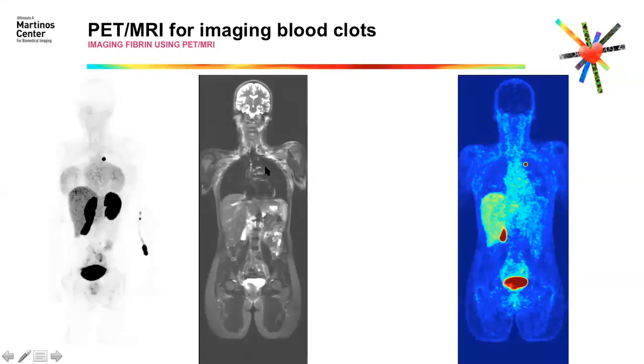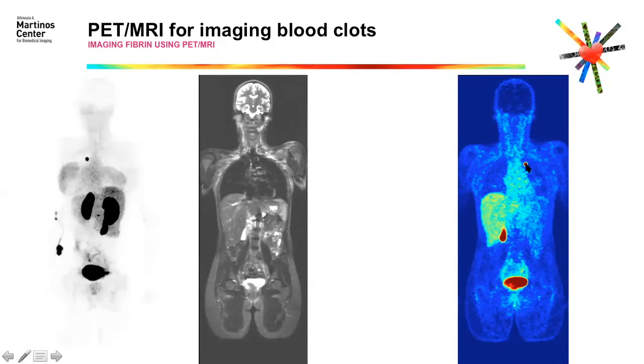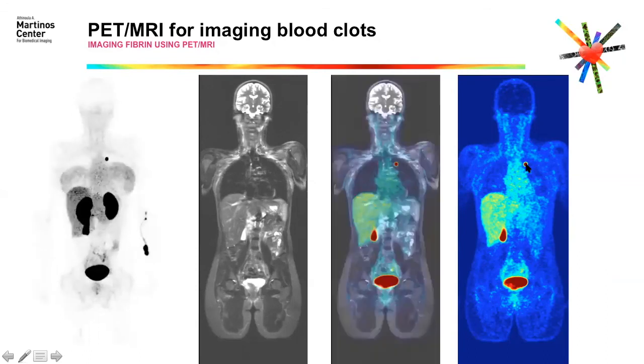And no matter how good your high resolution MR image is going to be, you will never detect this because this is really incredibly tiny. It's subclinical, there are no clinical symptoms. This patient was absolutely perfect, yet the patient still had a small blood clot.